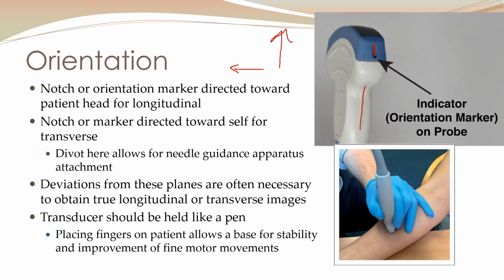Now, holding the transducer has a number of different approaches, and with the considerations of musculoskeletal work injuries these days, they're becoming more ergonomically accessible or helpful. There's a few different recommendations as to how you hold it. You never want to hold your transducer up in this region, because it really limits the fine motor detail that you can accomplish with your hands. Most ultrasound, we're really making very, very subtle adjustments that make significant changes to the image. So if we're holding too far back on our transducer, we lose that control.